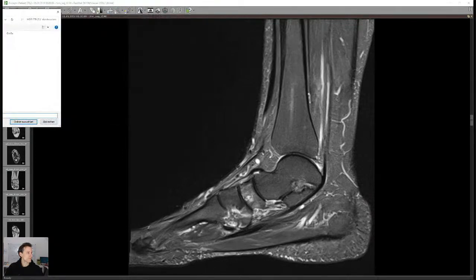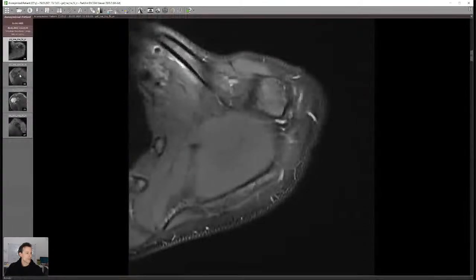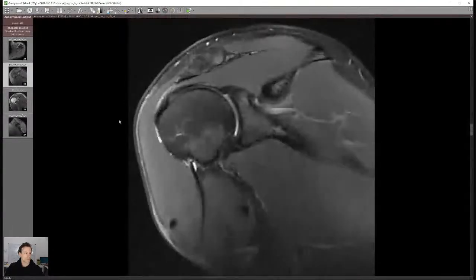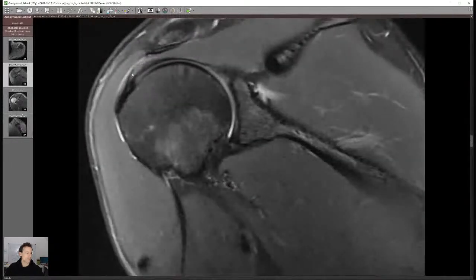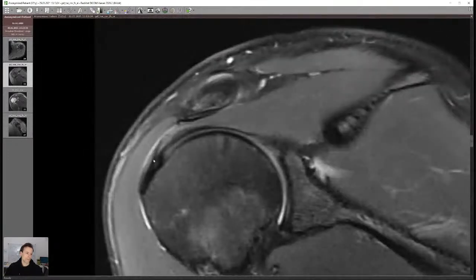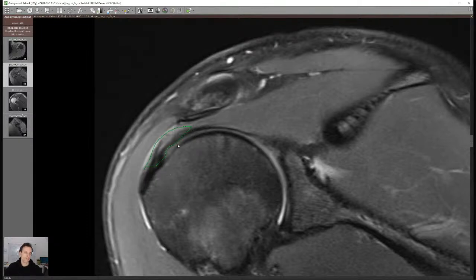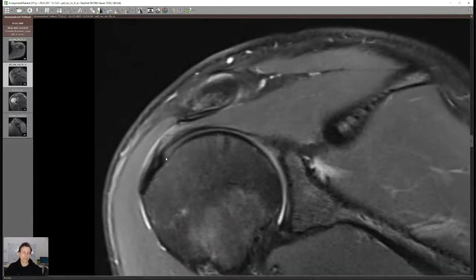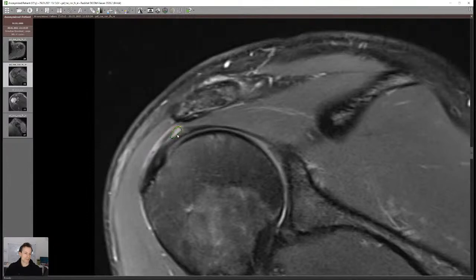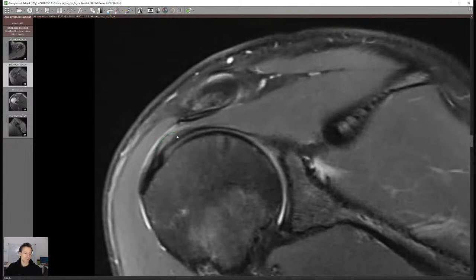Let me quickly open a case — a 20-something-year-old patient. Here at the supraspinatus level: if you think this is tendinopathy I would argue it's probably normal. If you call this tendinopathy then every patient in your practice from now on will have tendinosis. Check younger patients — it's not always perfectly black in this region. If it's just a little higher signal and not thickened or bulging, I don't even call it tendinosis.